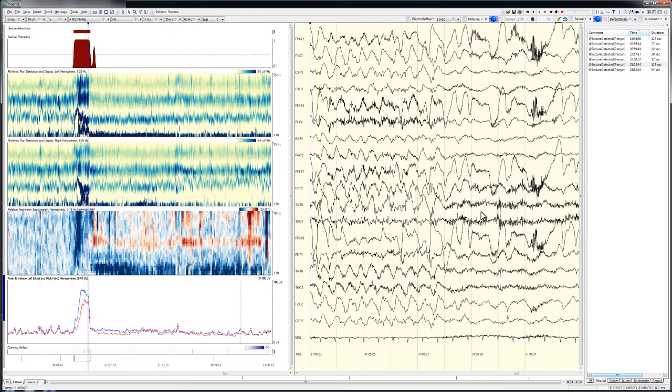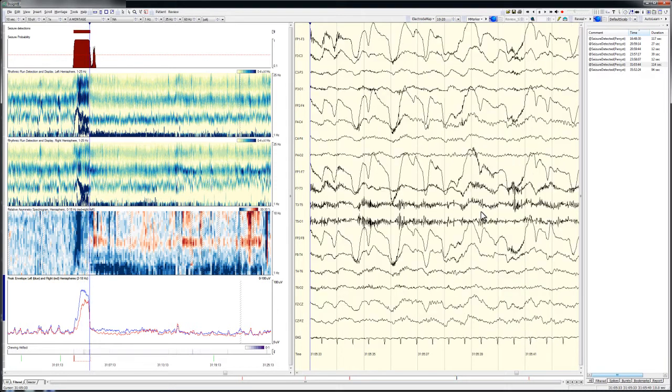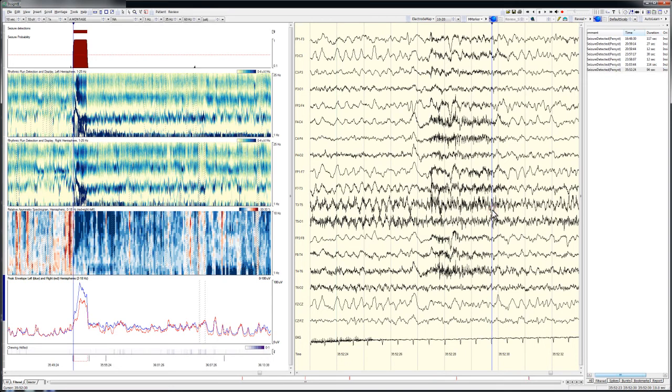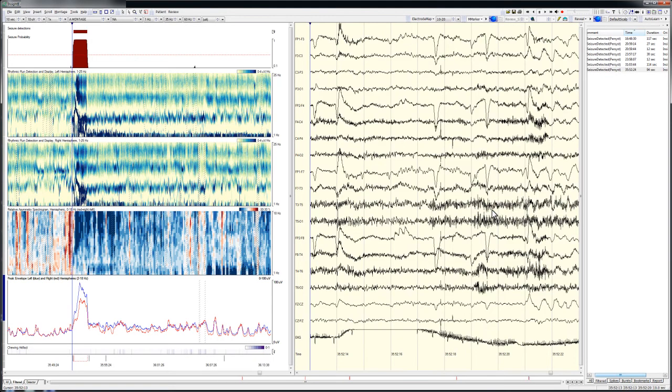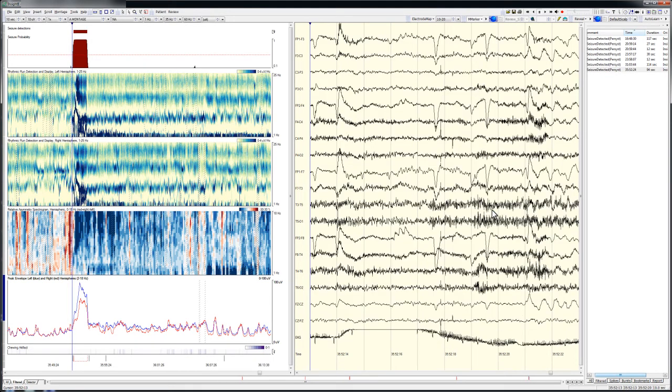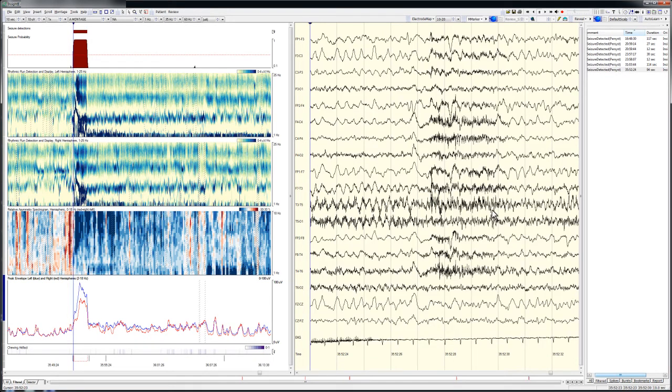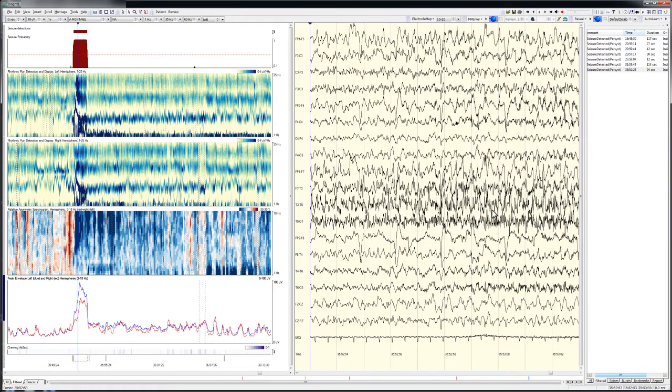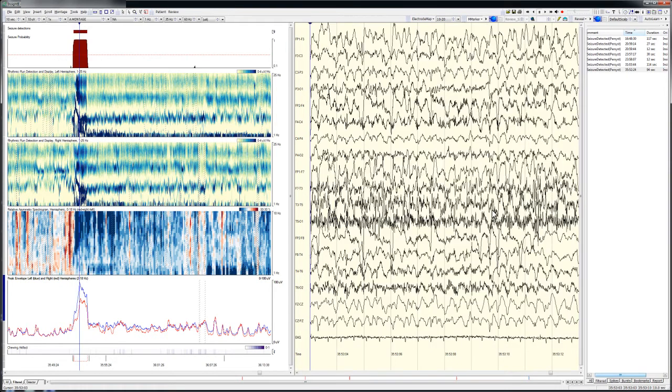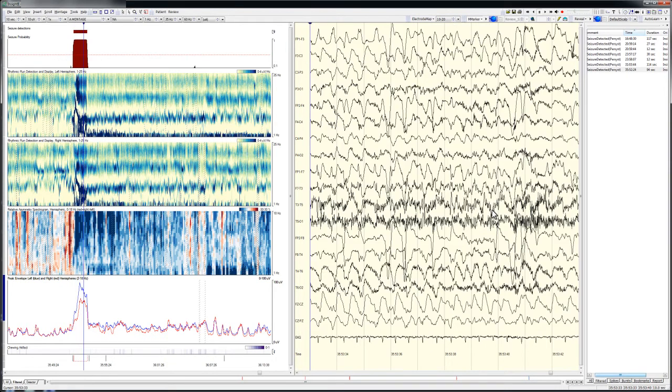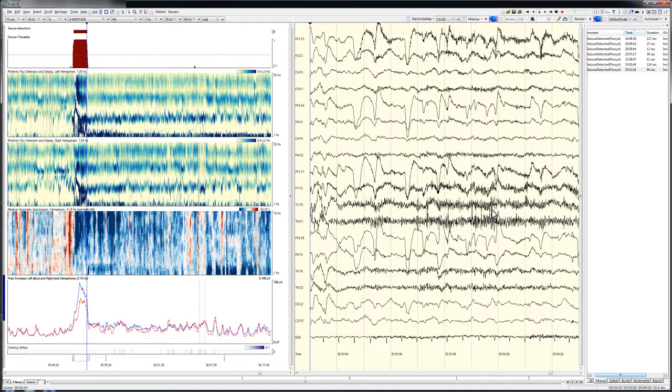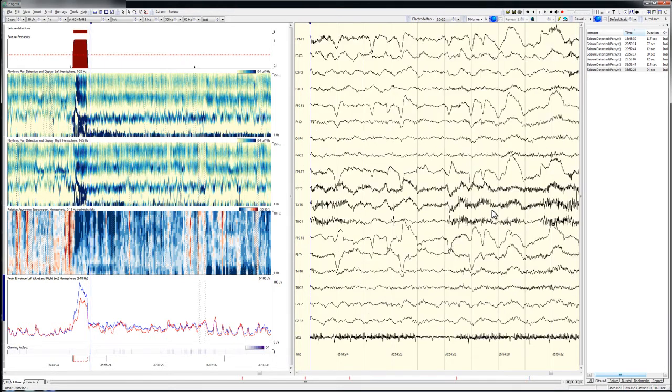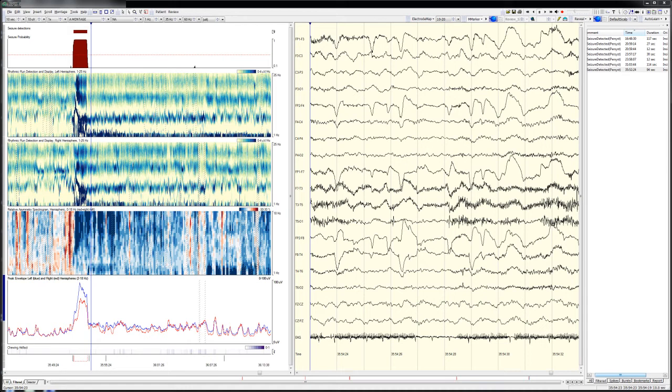This level of accuracy is commonly seen with Persist's latest generation seizure detector. The algorithm is much more accurate than previous generations of detector software. The false positive rate is very low, usually only one or two per day in adults and school-aged children undergoing EMU evaluation. The detector's ability to correctly mark real seizures is also much improved compared to prior generations. In Persist's internal testing on a large set of prolonged EEGs, the detector correctly marked, on average, about 90% of all seizures.